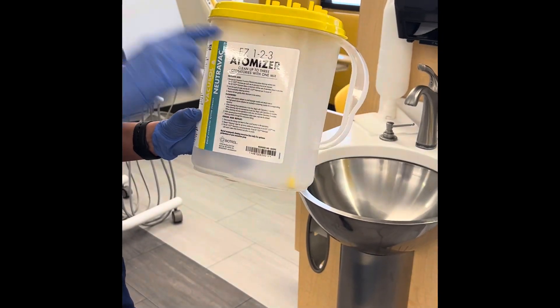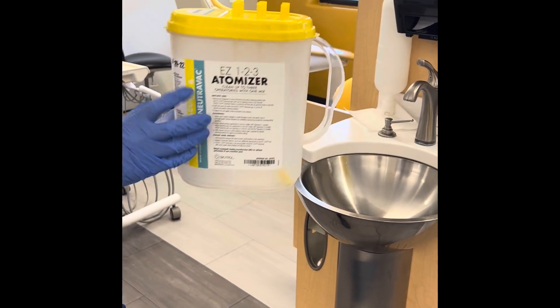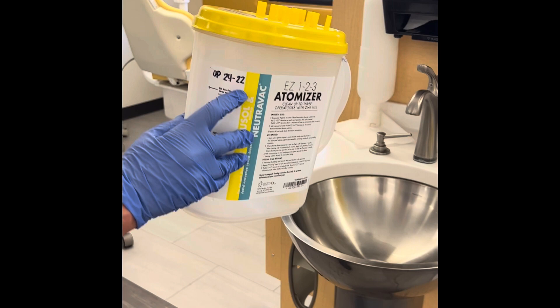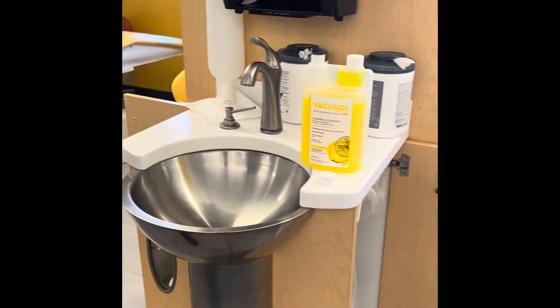You can clean three operatories. We use it for two — Operatory 24 and 22. For these two, it is stored underneath the sink.